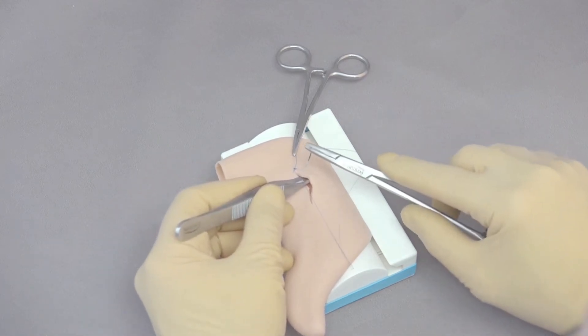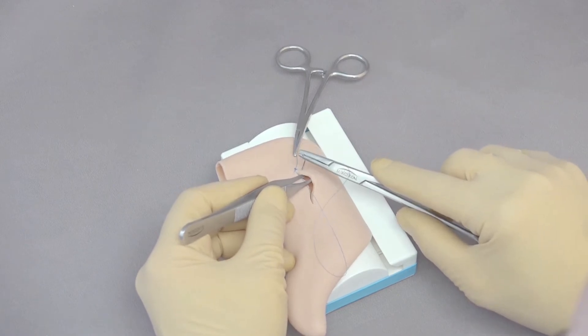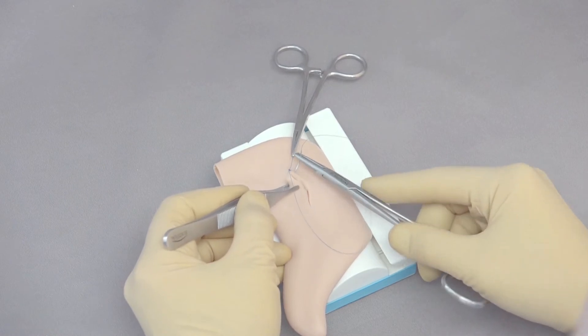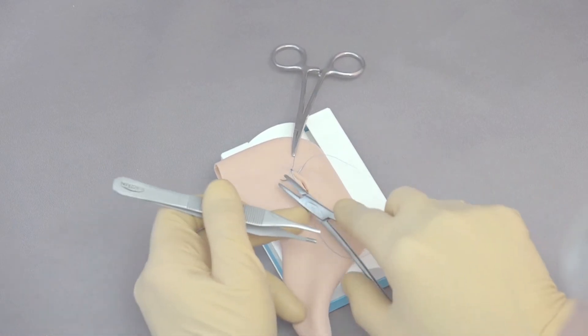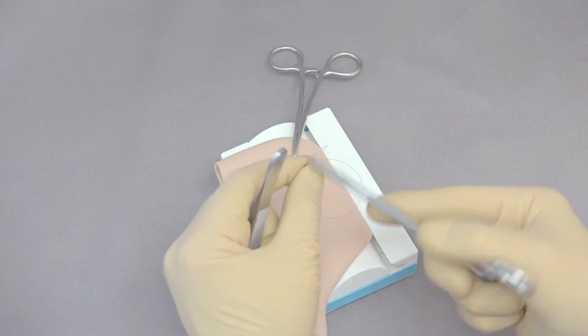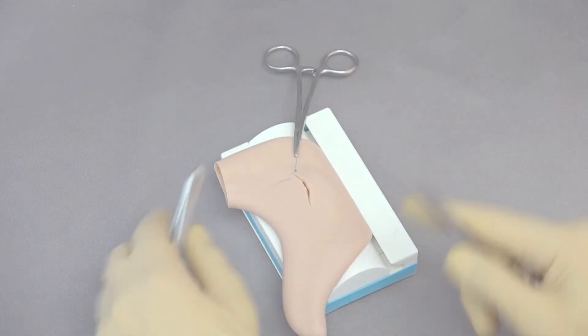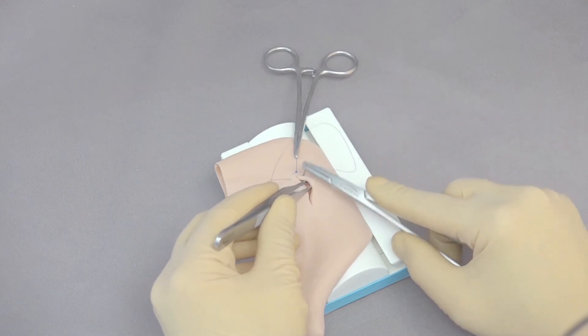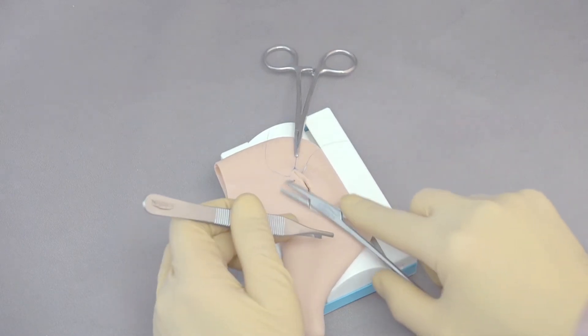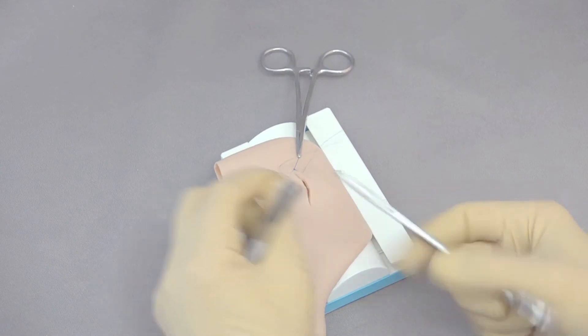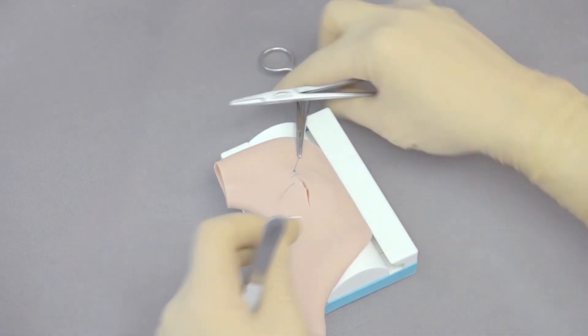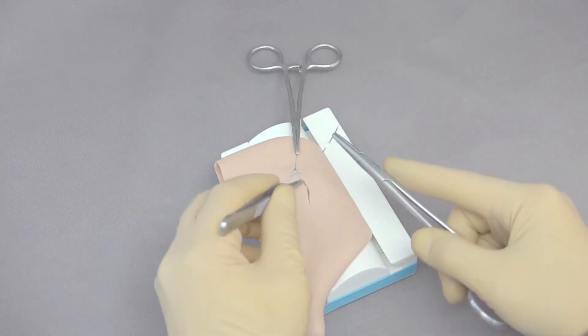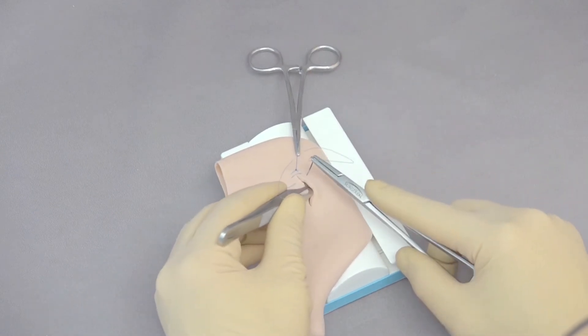I'm going to use the thumb forceps in the middle, about two to three millimeters from the edge of the incision, and go through both sides, because this is so close together. If this is gapping a lot, I can go through one side and then the other. Most of the time, we're going to do an oppositional pattern in the stomach. If you're working in a foal, you might consider doing an inverting pattern, but for people and in small animals, the oppositional pattern works very well.